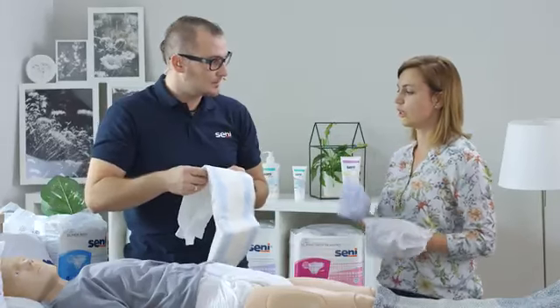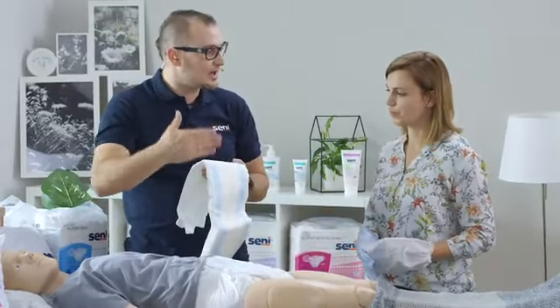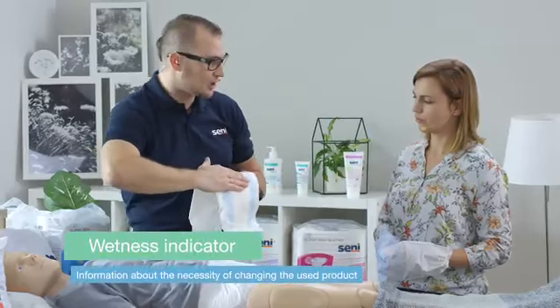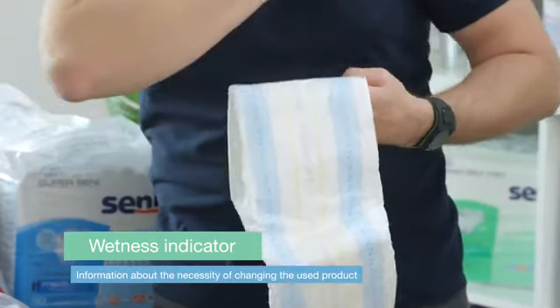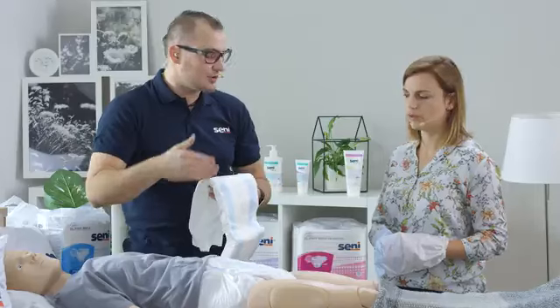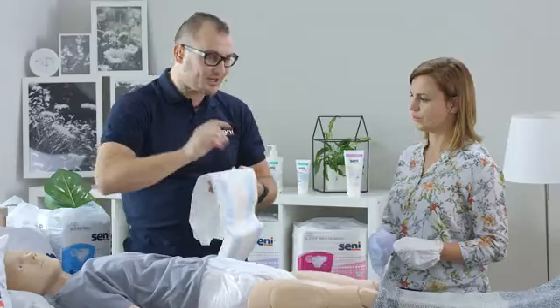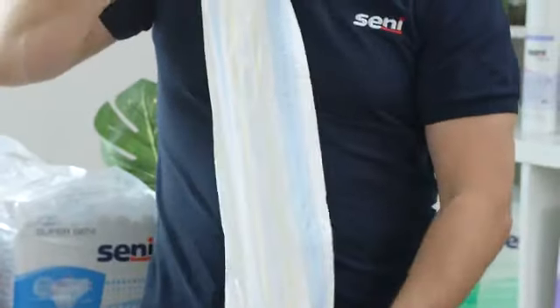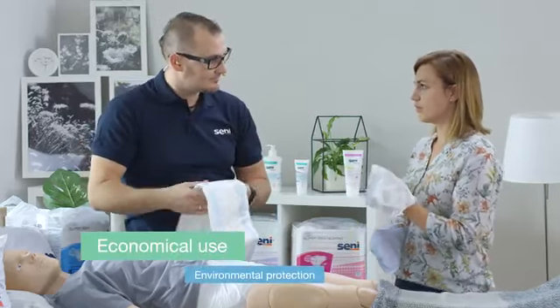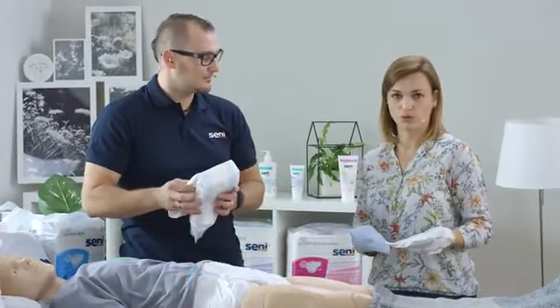So you are saying that they will be enough for one urine excretion, the second one, or a third or a fourth one, depending on how much will be excreted at that time. For example, if a length of about 3 or 4 fingers is blurred after a single urine excretion, there is no need to change. Exception, fecal incontinence, when of course you must change the product immediately. But in case of urinary incontinence, we can wait until about 80% blur of this wetness indicator. On one hand, this solution is very economical because we replace the product when it is needed. And it is also ecological because the less products we use, the better for the environment.